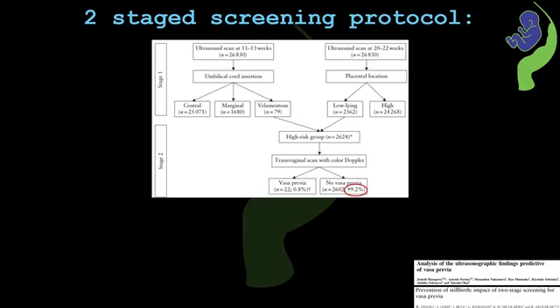From the 20 to 22 weeks anomaly scan, we should assess the placental location, and low-lying placenta or placenta previa becomes the high risk category, whereas a placenta situated in the normal upper or mid uterine location becomes the low risk category. So in stage 1, velamentous cord insertion from the first trimester and low-lying placenta or placenta previa in the second trimester are grouped under the high risk category.